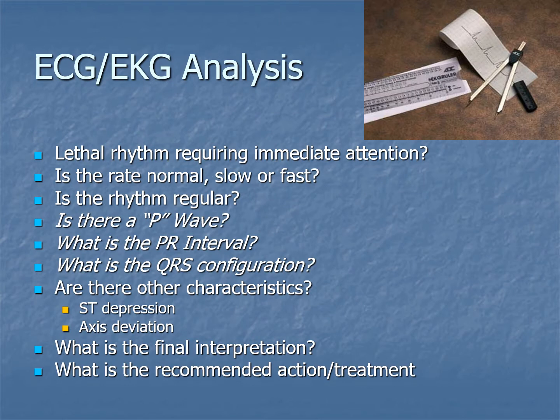Like a lot of what we do, the analysis of the EKG is done in a stepwise fashion. So when we assess a patient in general, we assess them in a stepwise fashion. We look at them. We look through the various bodily systems in the electronic health record, or if it's just a hard copy, the chart itself. And we do a lot of deductive reasoning, a lot of collaboration with other members of the healthcare team in order to analyze what's going on. Likewise, with an EKG, we're doing a similar process, but it's focused strictly on the rhythm strip that we're getting as part of the overall clinical picture of the patient.